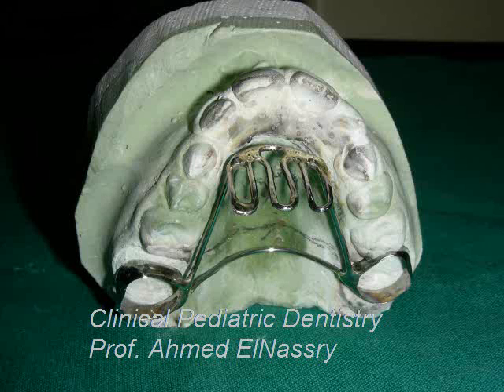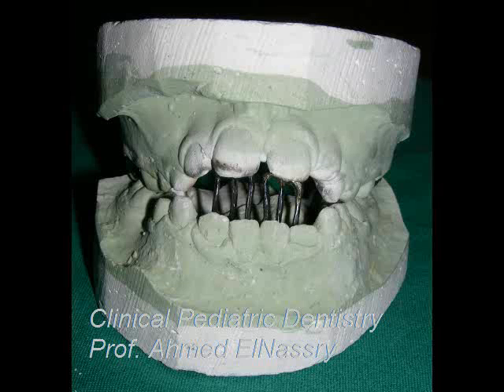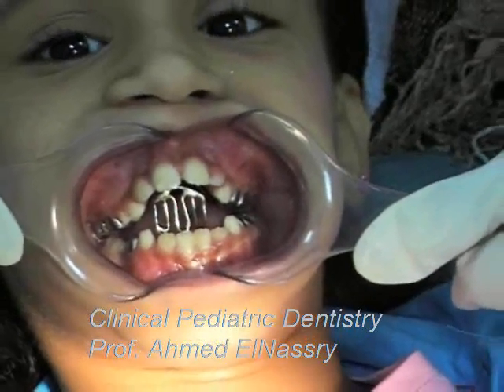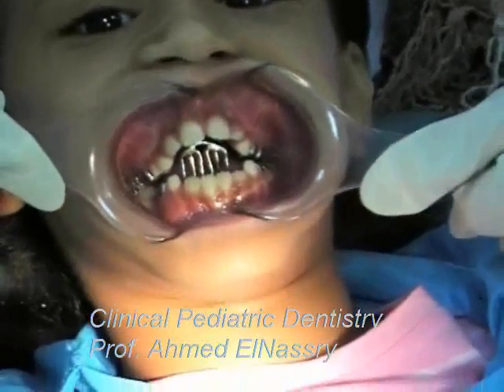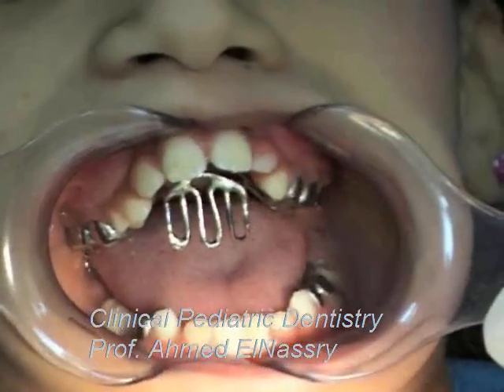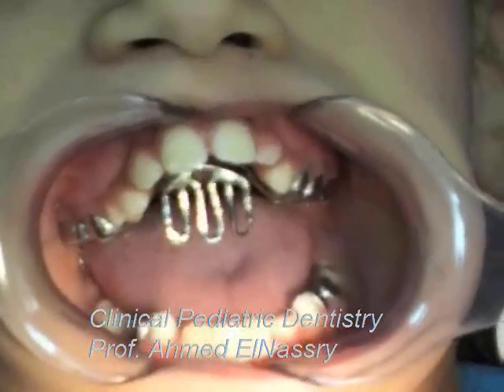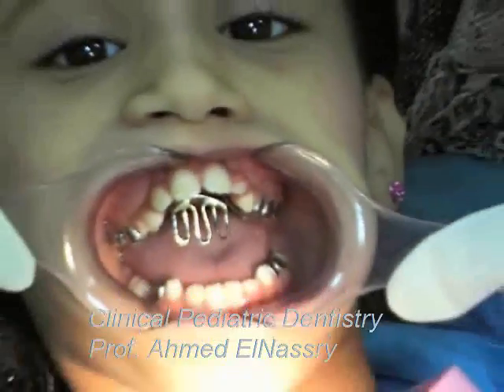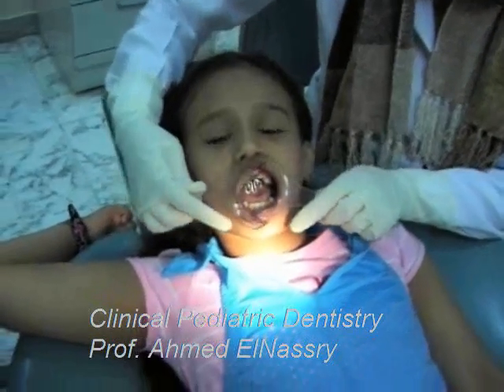The wires are soldered to the bands. The aim of this appliance is to construct an anterior curtain to prevent the tongue — which is a strong muscular organ — from protruding between the upper and lower front teeth, causing the anterior open bite that leads to deformity of the jaw and breaking the anterior seal of the mouth.